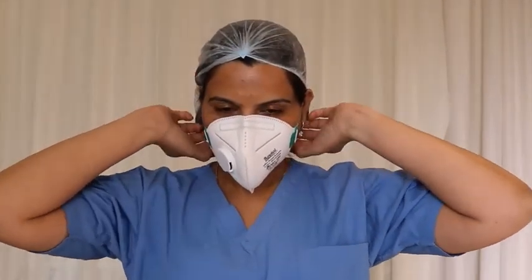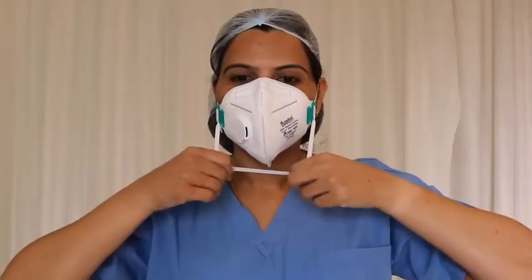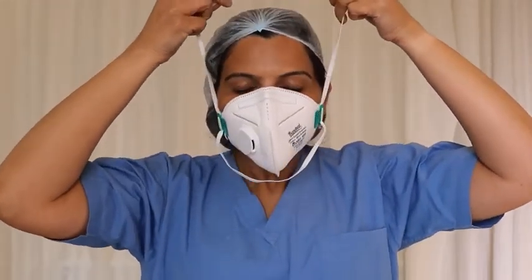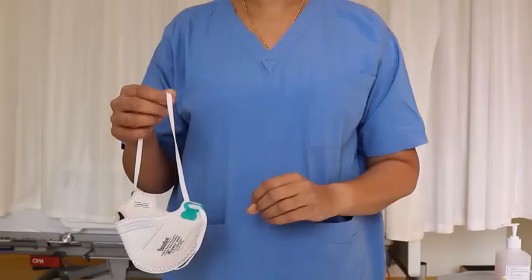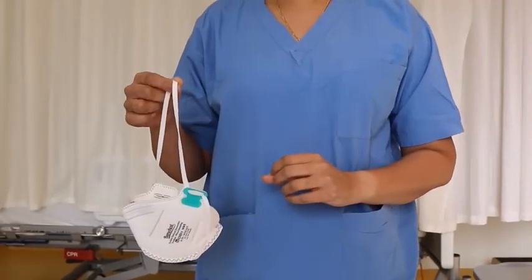The N95 mask is removed outside the patient room. The strap area is clean, so first remove the lower strap and then the upper strap. Make sure you do not touch the outer part of the mask, then discard it.